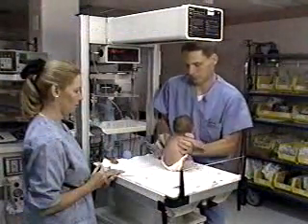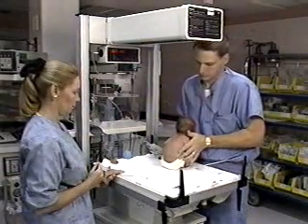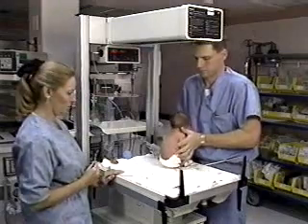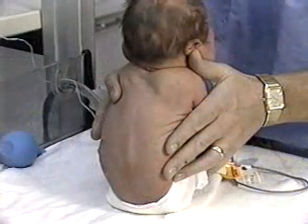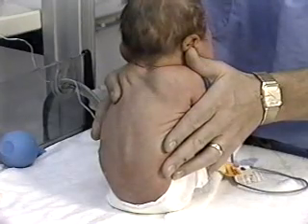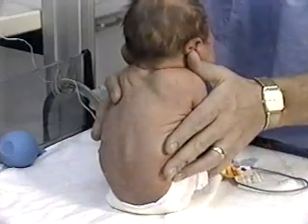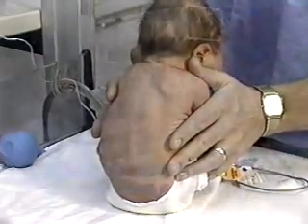The sitting position is also used. It may be preferable to the lateral decubitus position if there is difficulty in obtaining CSF. This position is more difficult to maintain, particularly in larger and more active neonates. Care must be taken to ensure that the airway remains patent or open.